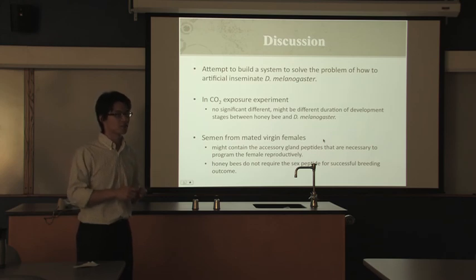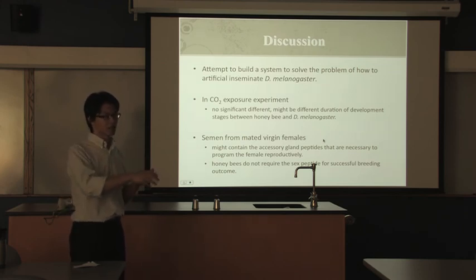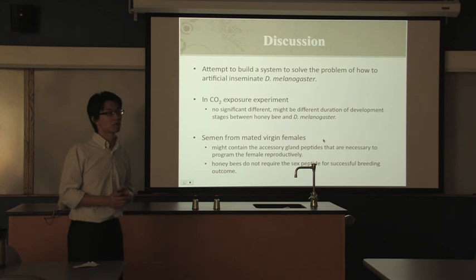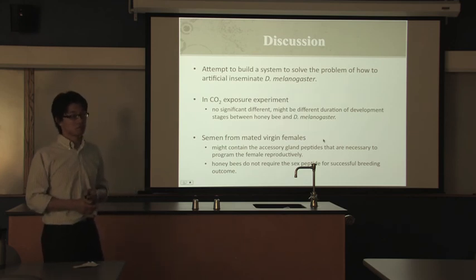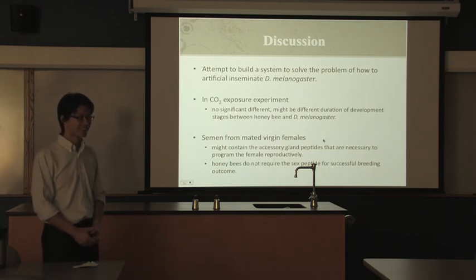But if you left it in maybe 5 minutes, not deeper, but left it there longer, it might stimulate her to lay eggs, or maybe create a plug that would keep her from ejecting the material. I'm just wondering if that might be something to consider. Okay, it's good to try.